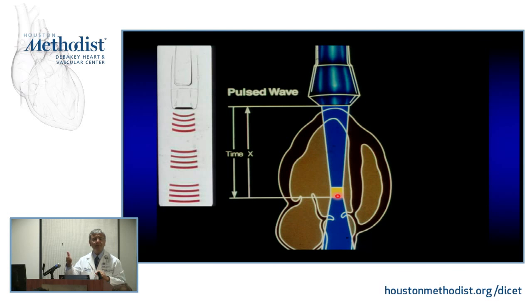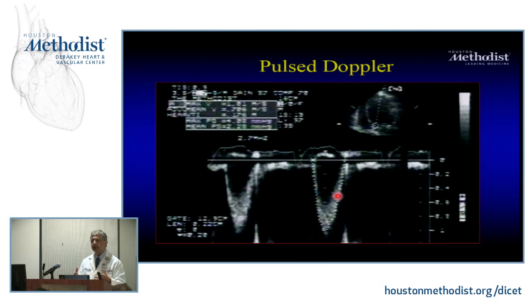I sent 3.5 megahertz. What is it now? It's 3.5 plus 300. And it's going positive, or negative in this situation, it's going away from me, so I can solve it. What do the physicists use? They use fast Fourier transform to be able to solve it. These are complex equations, and ultimately this is put in a spectral display for you to see.